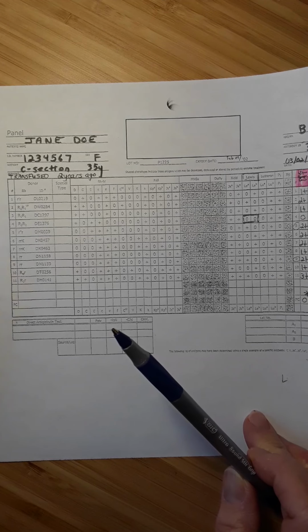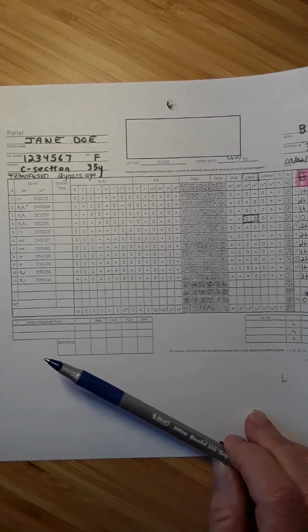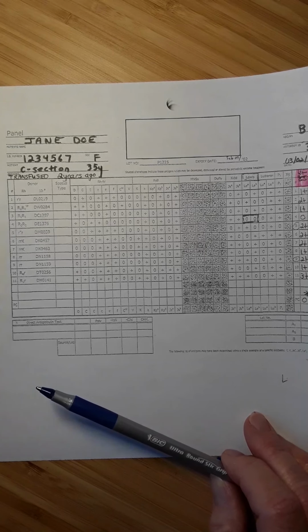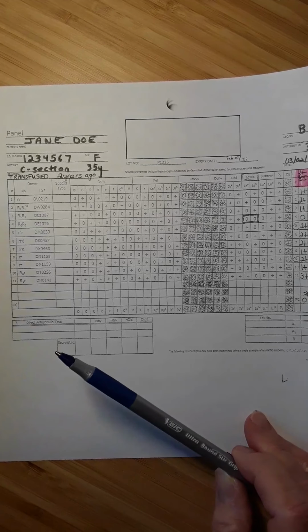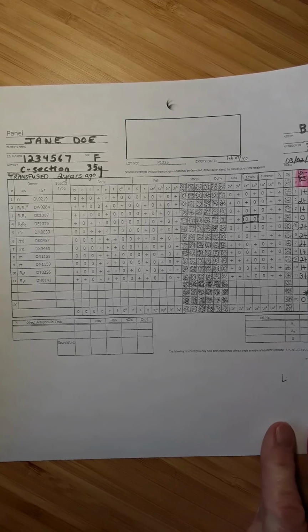After that, we performed the same things that we would do with an antibody screen. So we wash times 3, we add 2 drops of anti-human globulin, spin, read, and record, and then add check cells to the negatives. So this panel is just like a big screen. Think of it that way. It's often the easiest way to think about it.